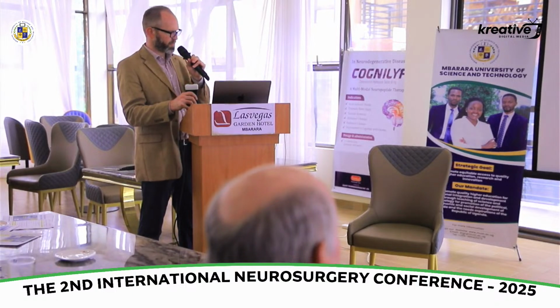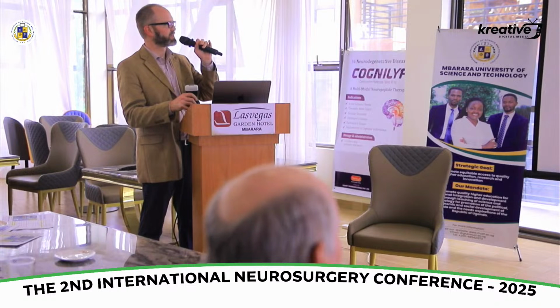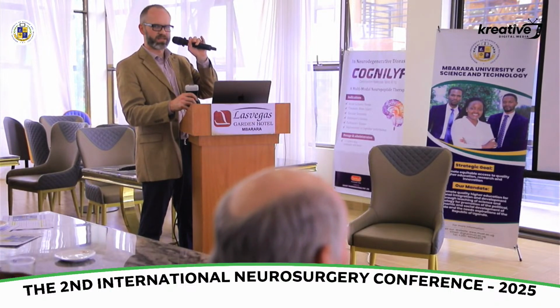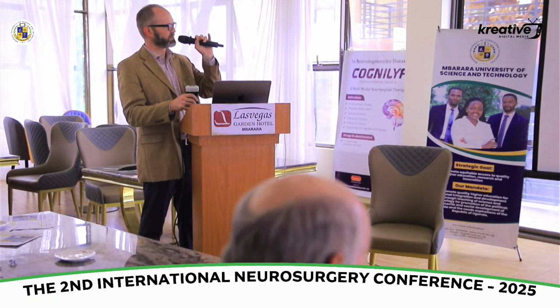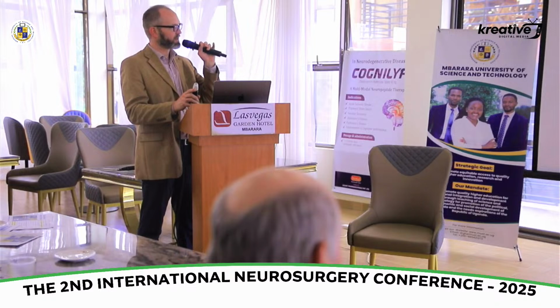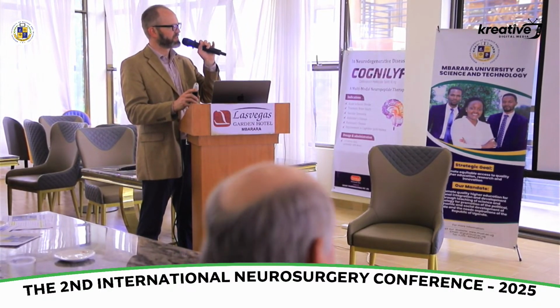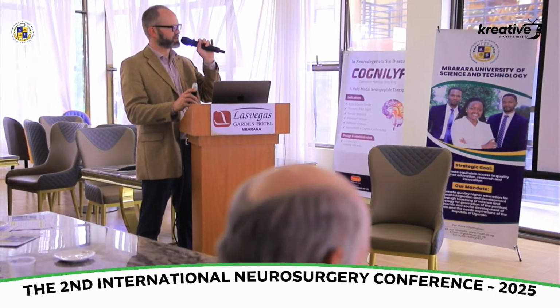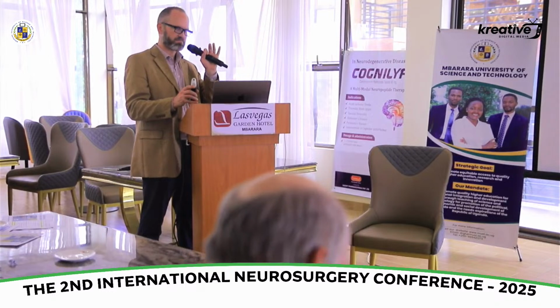It's getting warm enough that it keeps freezing to turn itself off. That's a problem with handhelds, you do have a time limit on utilization, but you can get the idea. And then here, when we come in on the sagittal, it's a little harder to see on this view, so I think we'll go to Dr. Kava to look at the vascular imaging pretty quickly.